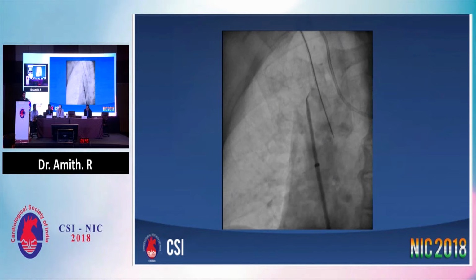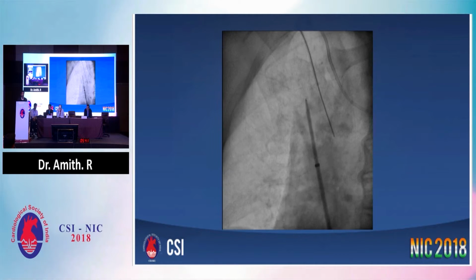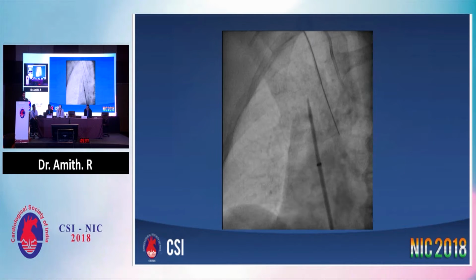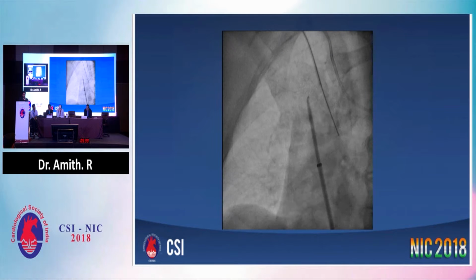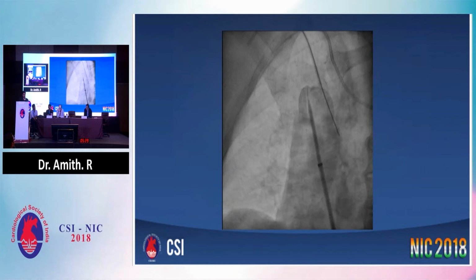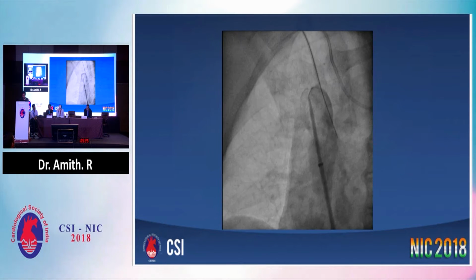And since we had used a lot of contrast till this procedure and the procedure also had taken close to an hour, we decided to abandon the procedure for that day with a plan to do needle recanalization in the next attempt. The same was communicated to the patient regarding the risk of vessel rupture or puncture, and the possible need of a surgical revascularization was also communicated.